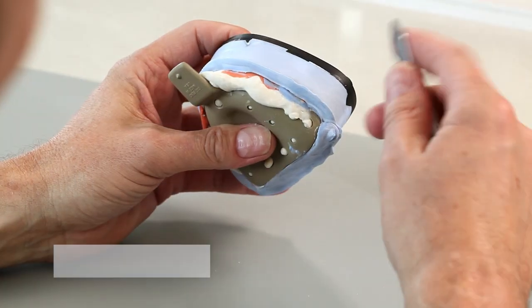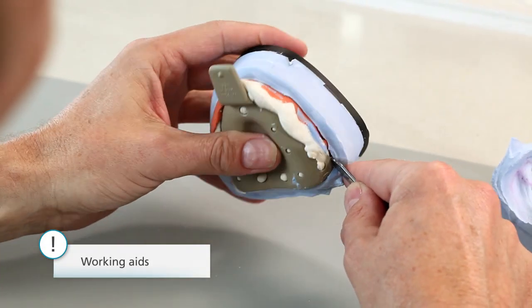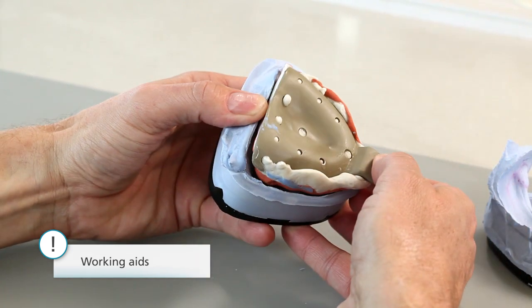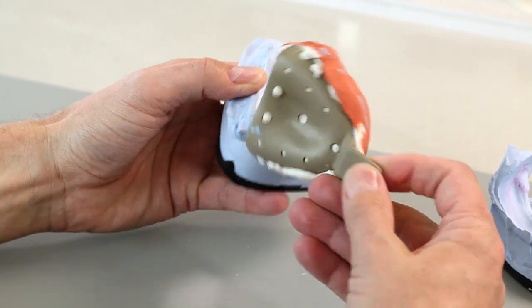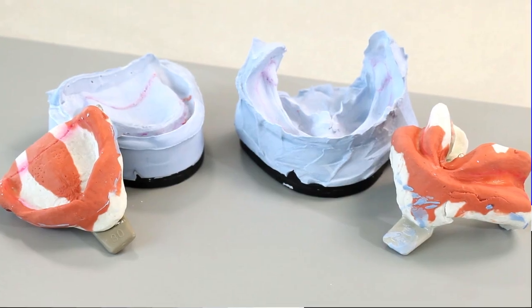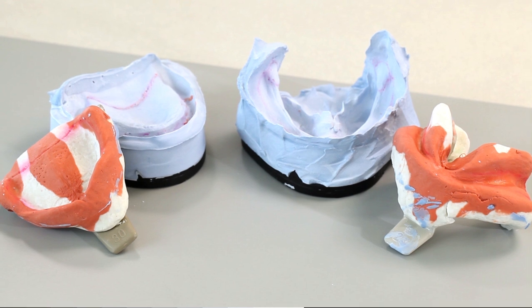Cast the models in dental stone in the usual manner using the preliminary impressions. After the dental stone has set, carefully remove the impression from the model. Make sure that all the information from the preliminary impression has been accurately reproduced on the model.